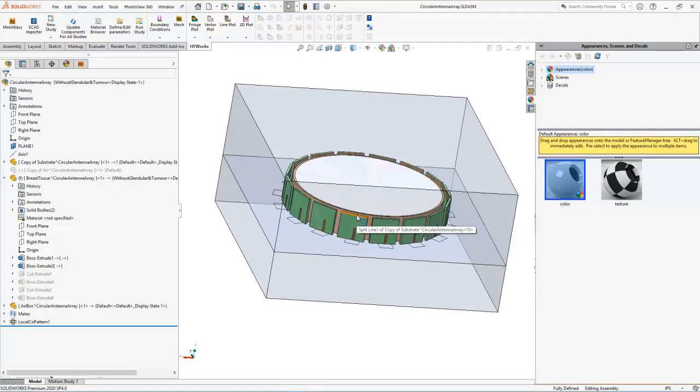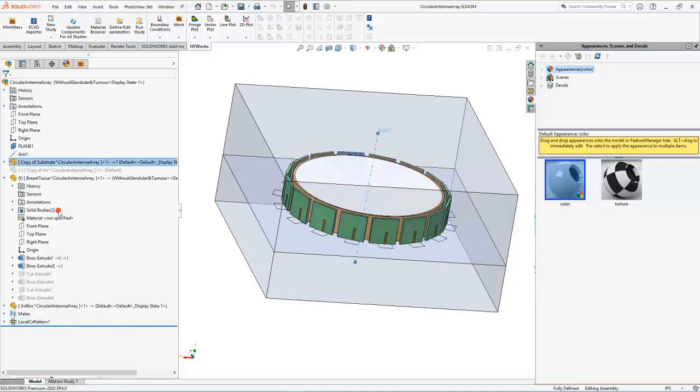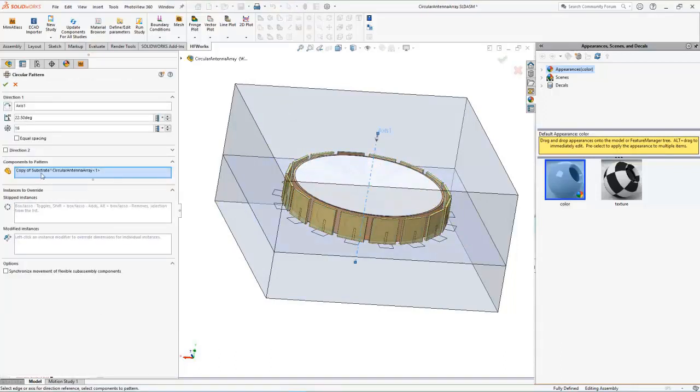To build the array, I used this nice feature inside SOLIDWORKS, circular pattern, that allows me to create multiple instances of a single antenna element. So here the array is formed by 16 antennas placed equidistantly around the breast phantom.